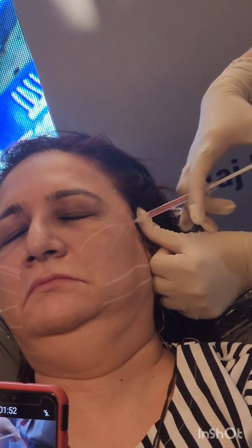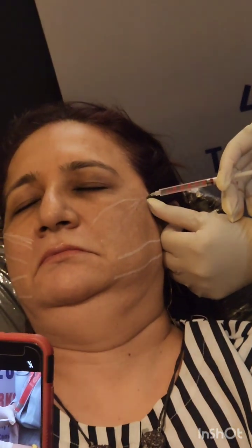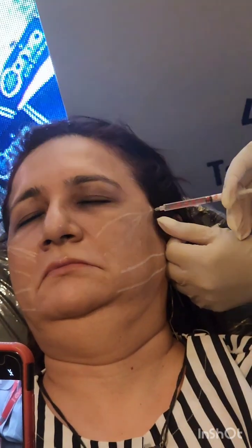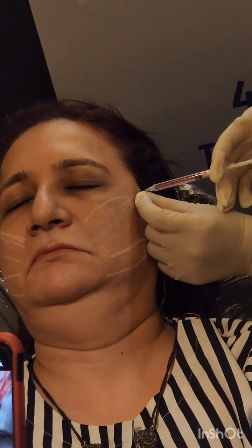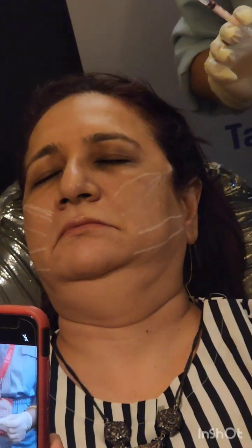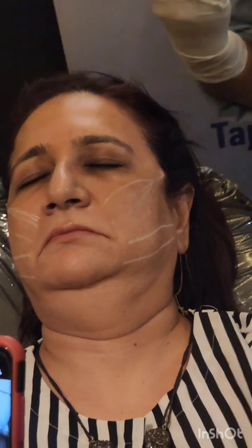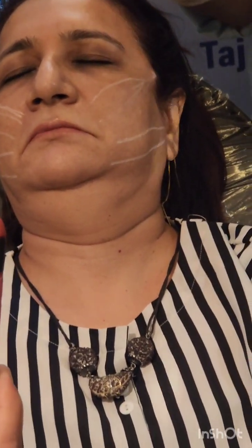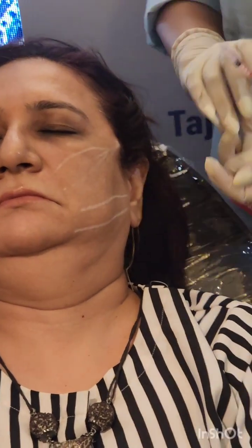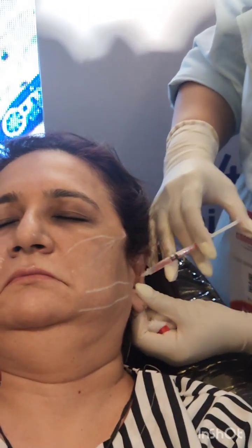Any questions? Keep asking, because later on we may not get time because there is another session of thread. You can give as many cc. 30 ml in one session is okay. In hair transplant, you inject how much? 30 cc, right? That is how our kidney can filter. So 30 cc is enough. You have enough adrenaline to inject, and anesthesia.